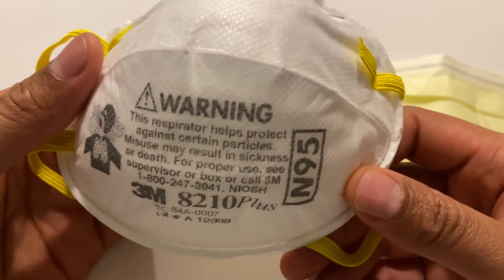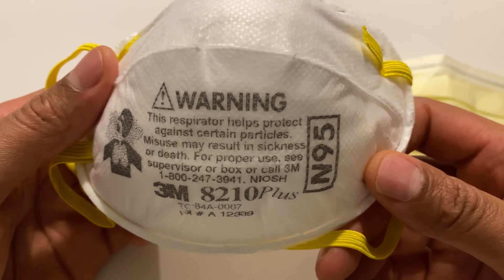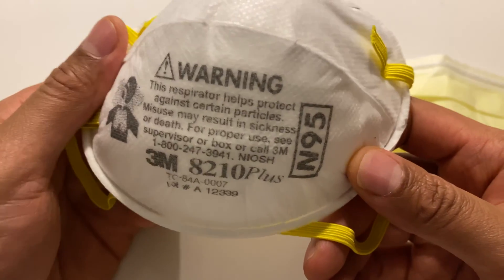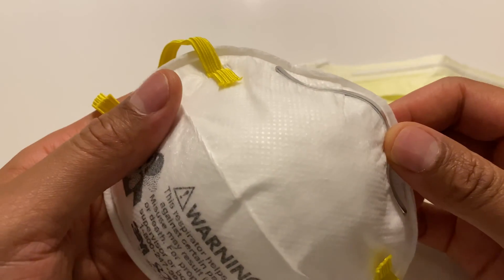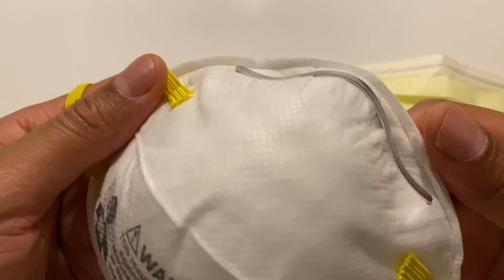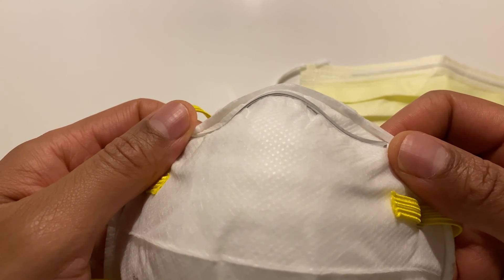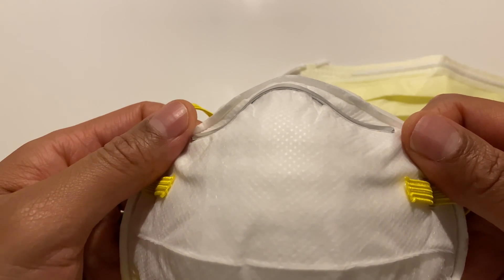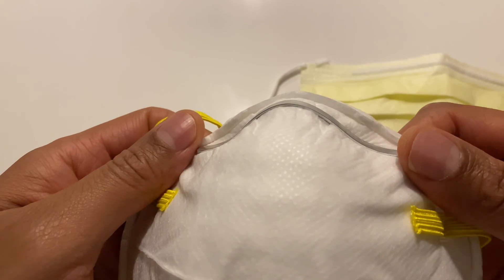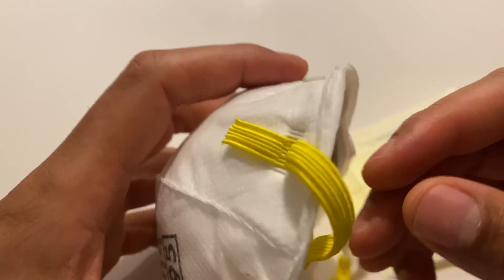The N95 mask is supposed to filter out 95% of small particulate matter down to 0.3 micron, once you get fit tested. Fit testing is a process you're supposed to go through to ensure that the mask fits over your mouth and nose securely, without allowing any particles to seep in through the side.